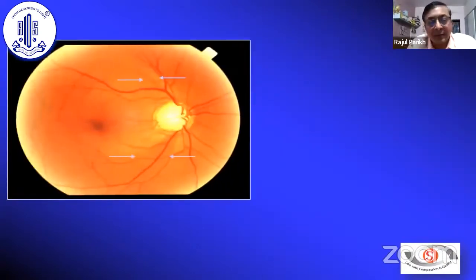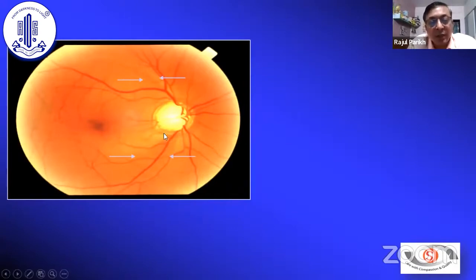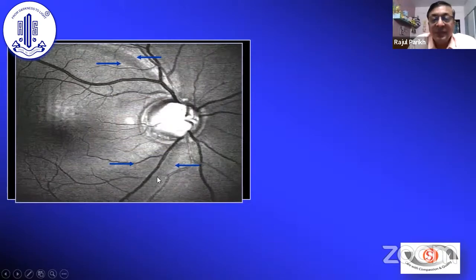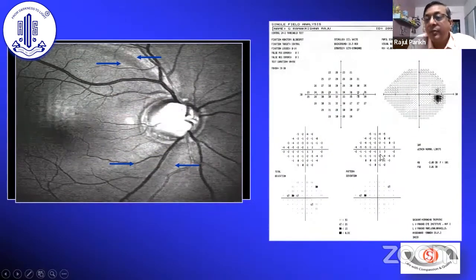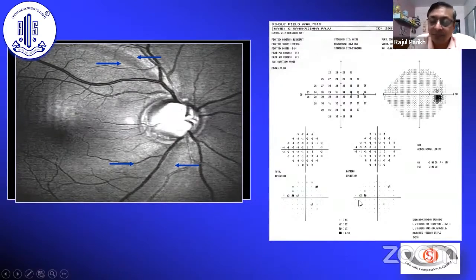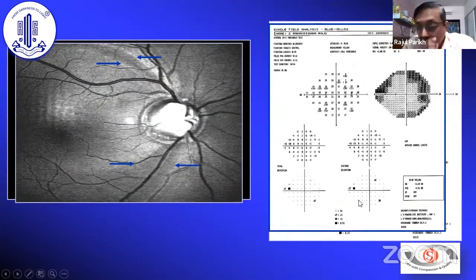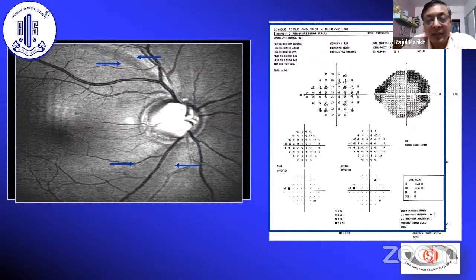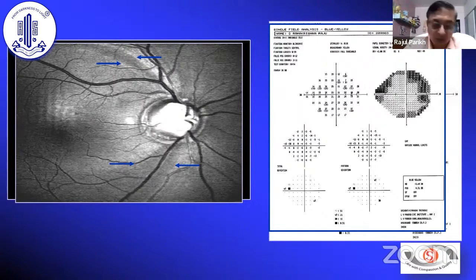For example, you can see the classic bow-tie shaped defect superiorly and inferiorly. It is more highlighted in the red-free photograph, and the white-on-white perimetry shows just a little bit of nasal step and blue-on-yellow also. So perimetry usually takes a little time in the early stage and has lots of test-to-test variability. Imaging plays a definite role in early picking up of disease.